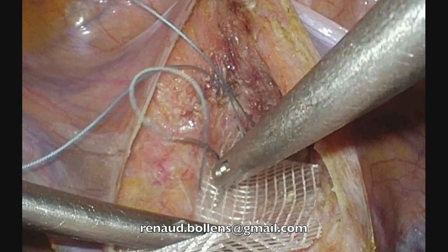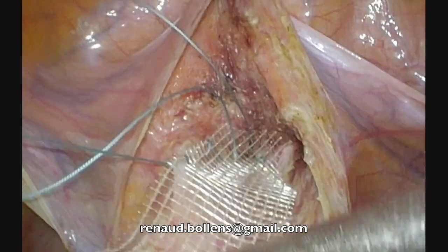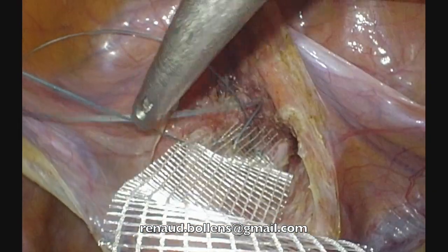I push, I turn, then I push. Okay, I pull, I must be careful because it's a 2-0 Vicryl.